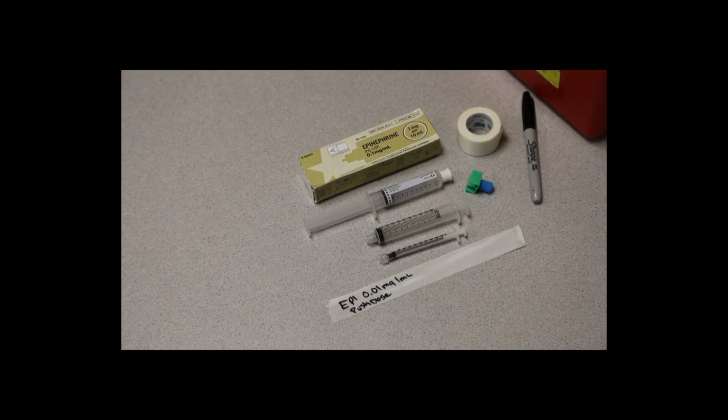I'm going to demonstrate the preferred method to mix and administer 0.01 milligram per ml epinephrine, commonly known as push-dose epi. Push-dose epi is used for persistent shock and hypotension unrelieved by proper volume resuscitation. Since epi does not come pre-mixed in a 0.01 milligram per ml solution, you will need to mix your own.